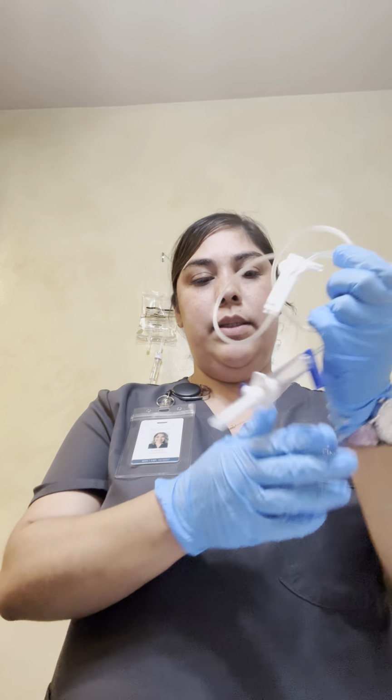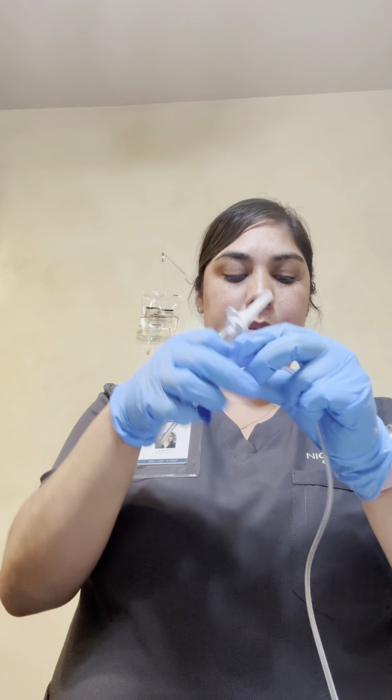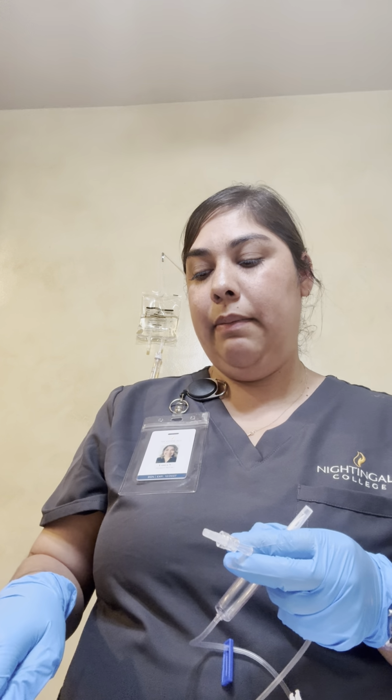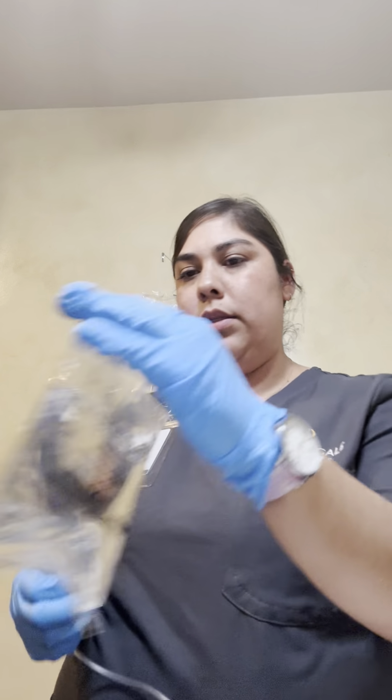We're gonna go ahead and set our second line. Same thing, we have our spike, we have our chamber, we have our rolling clamp, and then now we have our port access. You do want to make sure that each extension is compatible with each other. So I want to make sure that my medication tubing is compatible with my fluid one, which they are. I pre-checked. There's caps on everything, so we're going to go ahead and get this going. They're sterile.